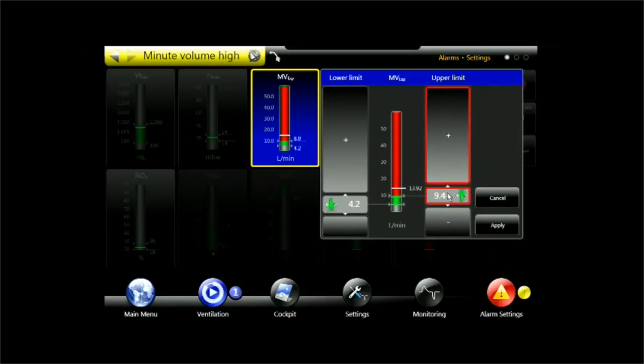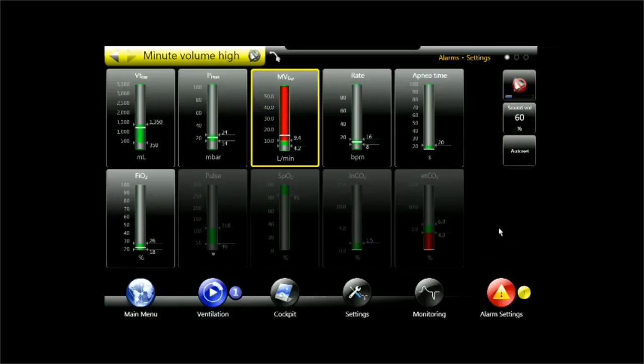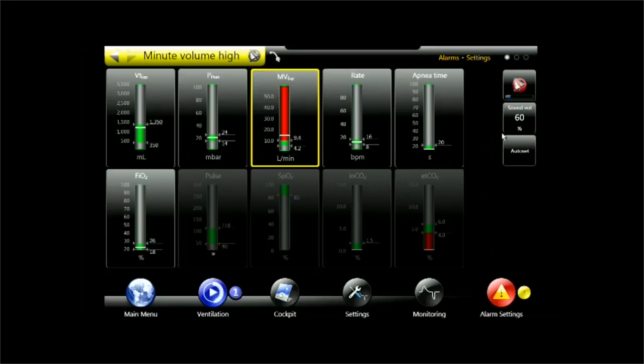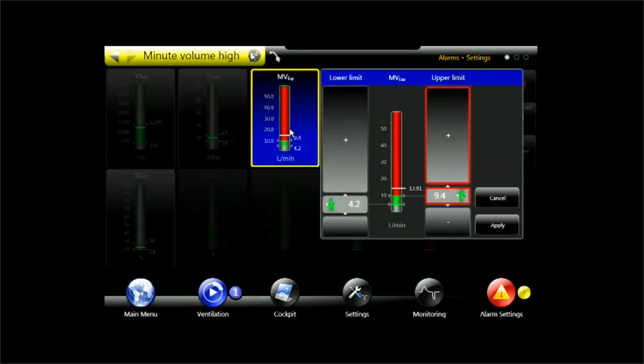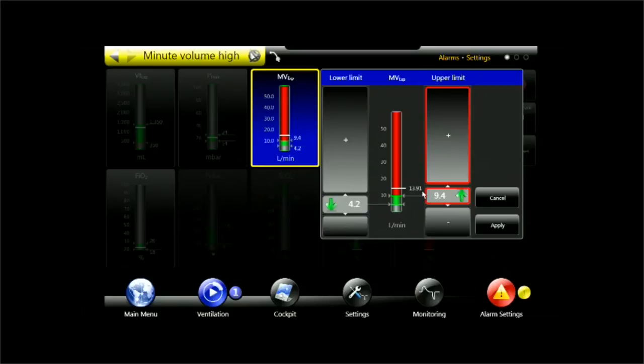Let me leave this for a moment to just show you another function which is convenient in one side and a little dangerous on the other and it's called the AutoSet. AutoSet adjusts all my alarm limits around the current value. So if I have a current minute volume of 13.9 liters per minute, then AutoSet will go and set the alarm limits above and below that limit.